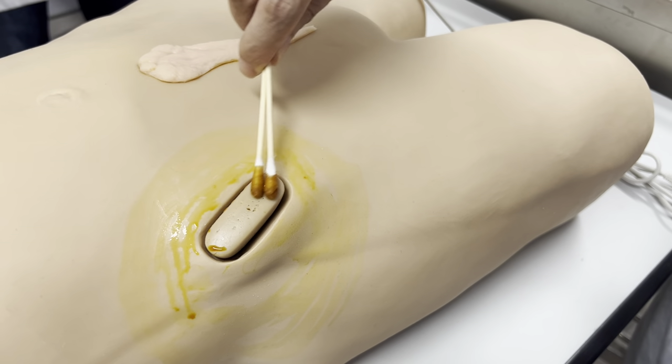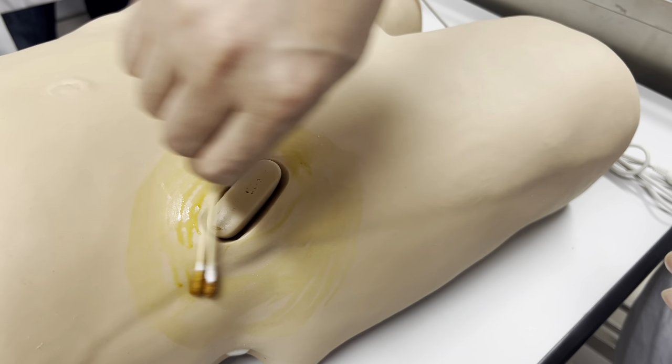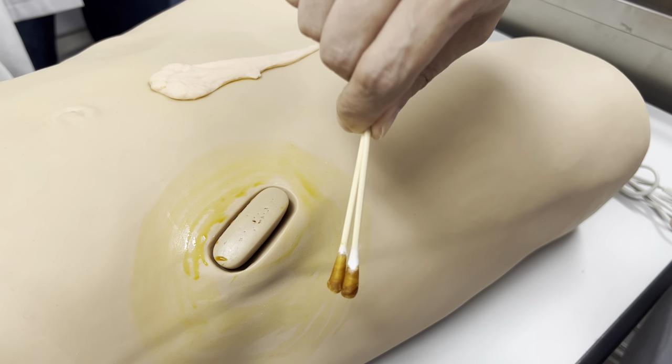We repeat also from the center to the outside, but this time it should be smaller than before.